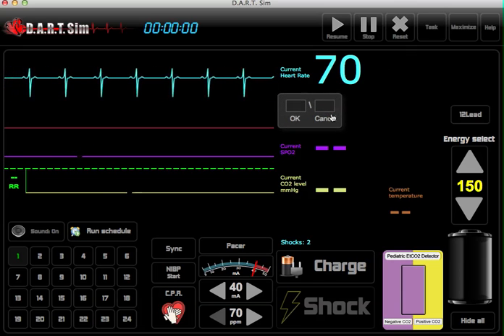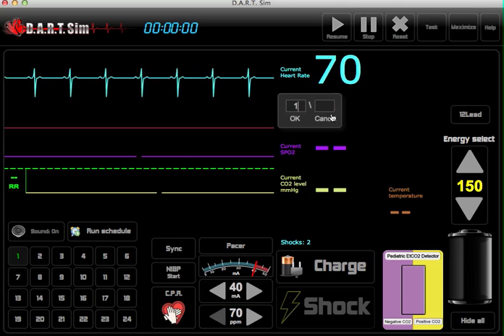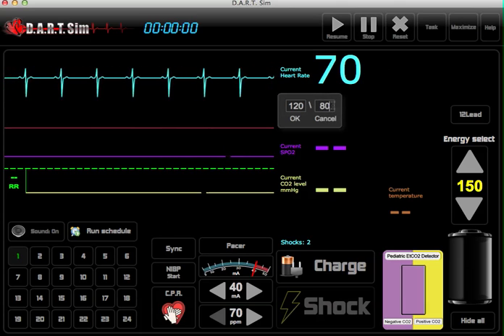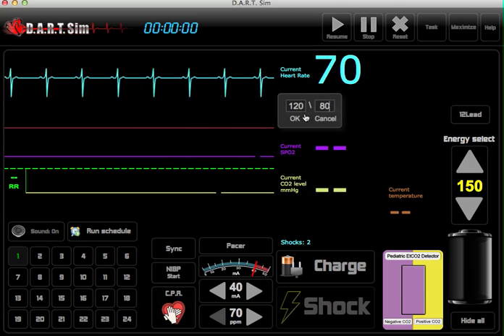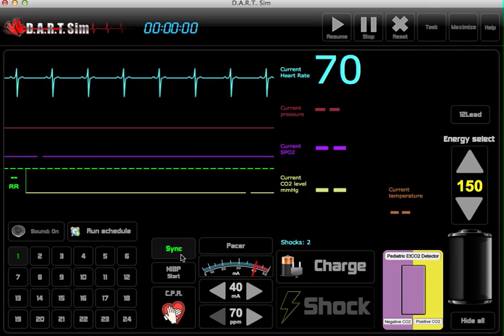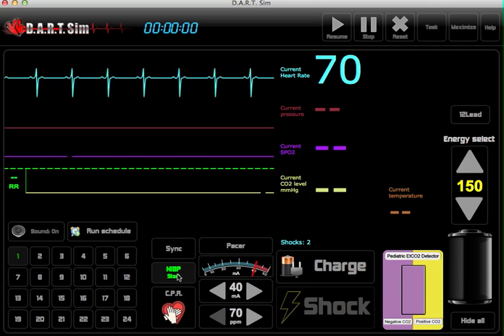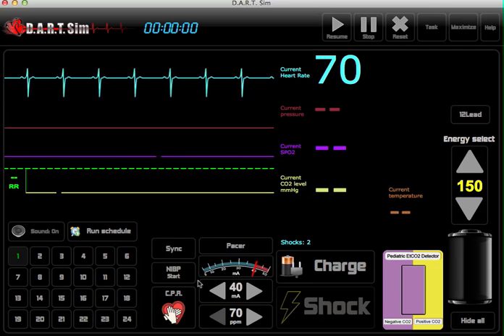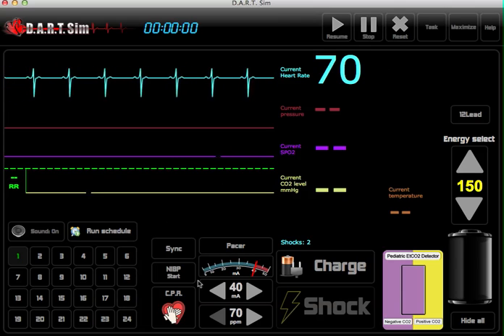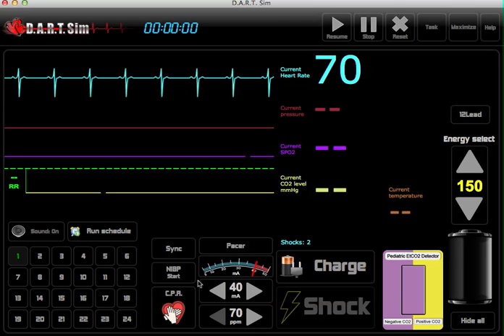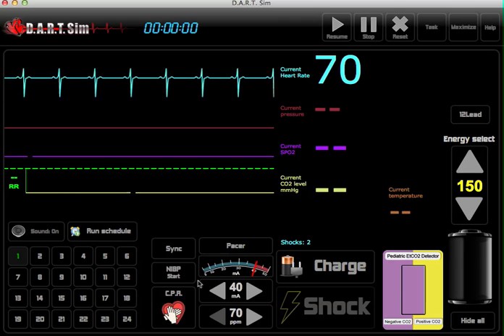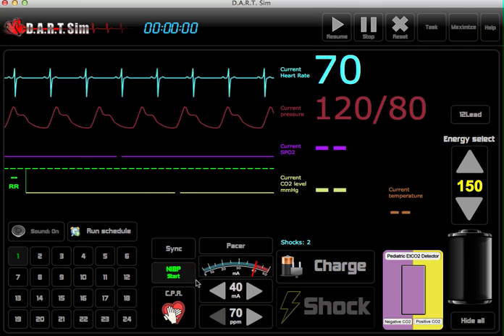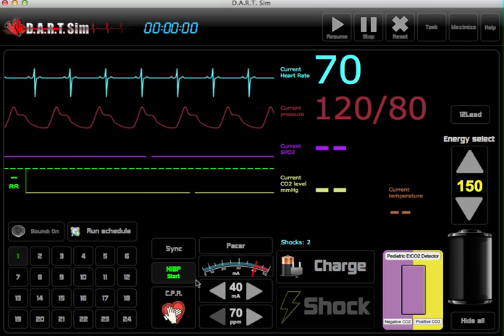We also have the option of entering a blood pressure manually. You can then activate the NIBP start button by pressing the N key on the keyboard, and then blood pressure will be displayed here.